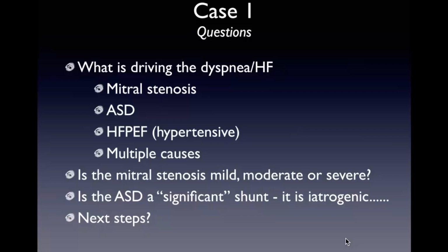What do you think, Flora? I think so. By numbers, it's in the range of moderate to severe. There is some degree of hypertension associated with this as well. There's RV dilatation, so perhaps the ASD is also involved in this degree of hemodynamic problems in this case.